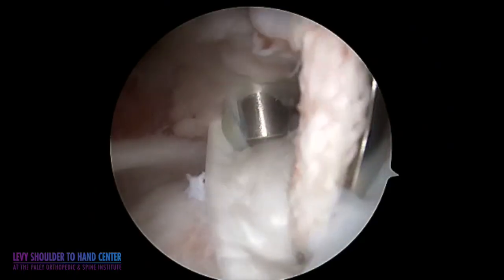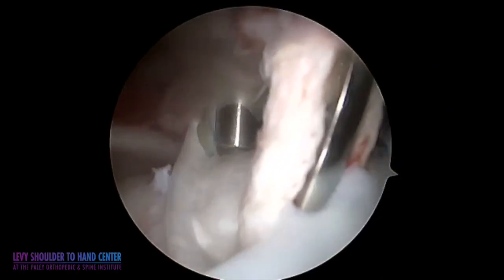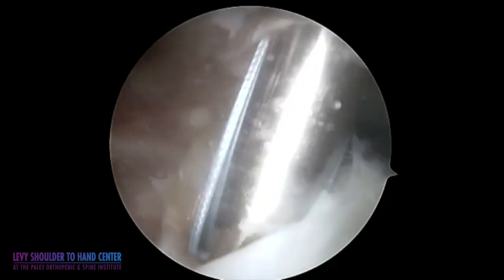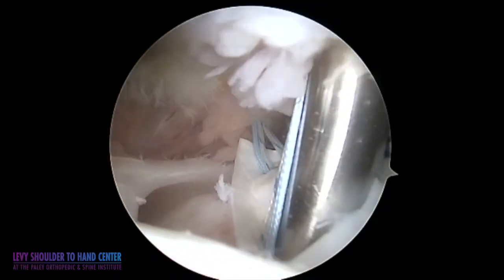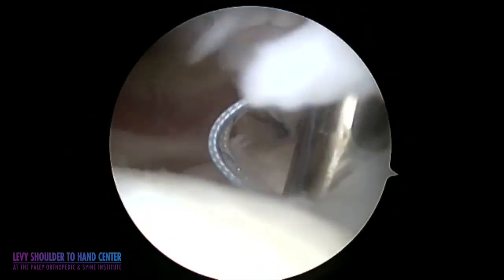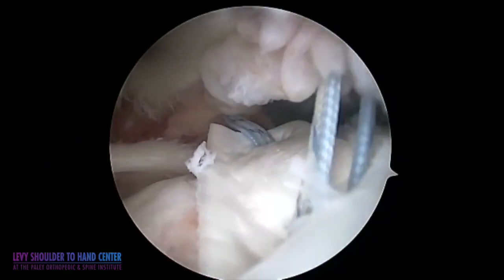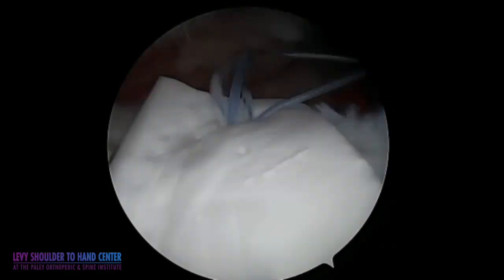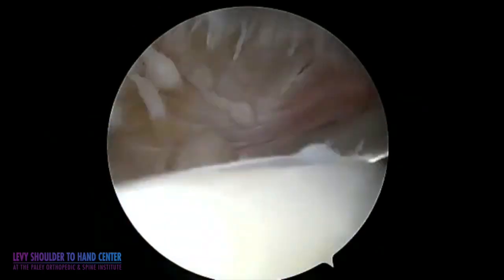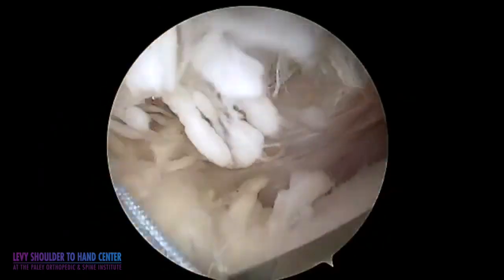The bone right at the edge of the footprint is typically strong, much stronger than the lateral bone, and it can support an all suture anchor. Here you can see the second anchor is going to be advanced, and at this point the remainder of the case is just as though you're repairing a rotator cuff. And here you can see this footprint expander. The bone marrow elements will leak through the anchor onto the nanofiber scaffold once the repair is done.